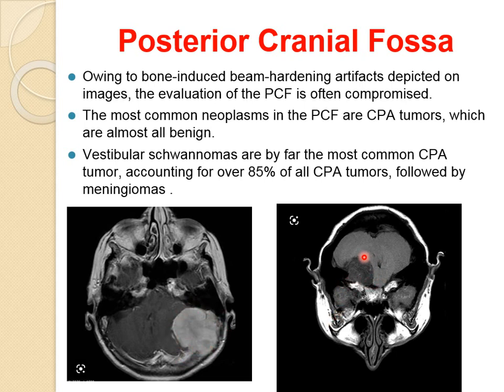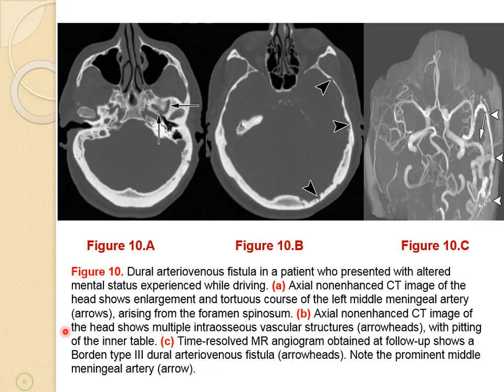And why is this a schwannoma, or vestibular schwannoma? It's not dural based. But what's the trick here? It's neural. It's extending into the internal acoustic meatus and causes widening of the internal acoustic meatus, which is very suggestive of schwannoma. Good.